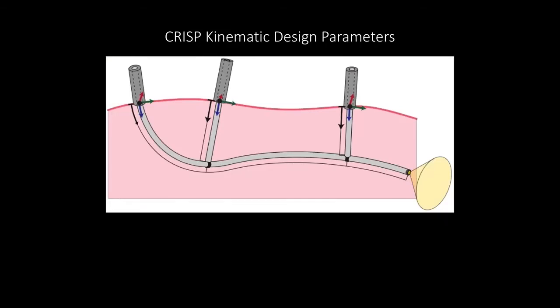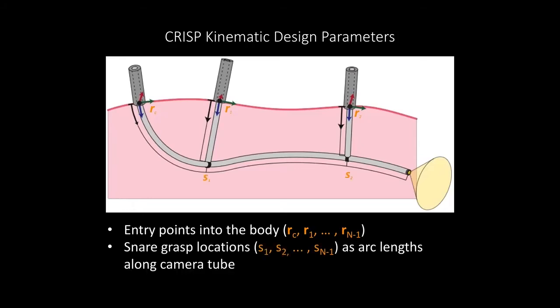to the surgical procedure. These parameters include the entry points where the tubes are inserted into the patient's body, as well as the snare grasping locations which dictate the parallel structures of the CRISP robot inside the body. It is important to consider these parameters as they can greatly affect the ability of the robot to visualize patient anatomy. Consider this 2D example here.